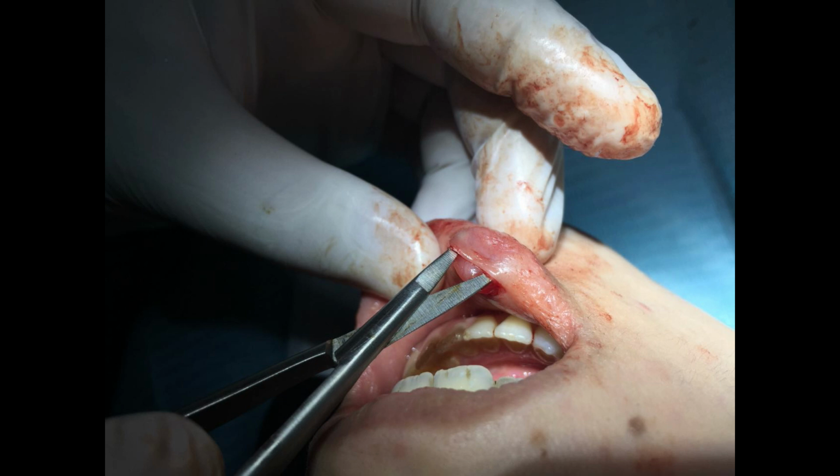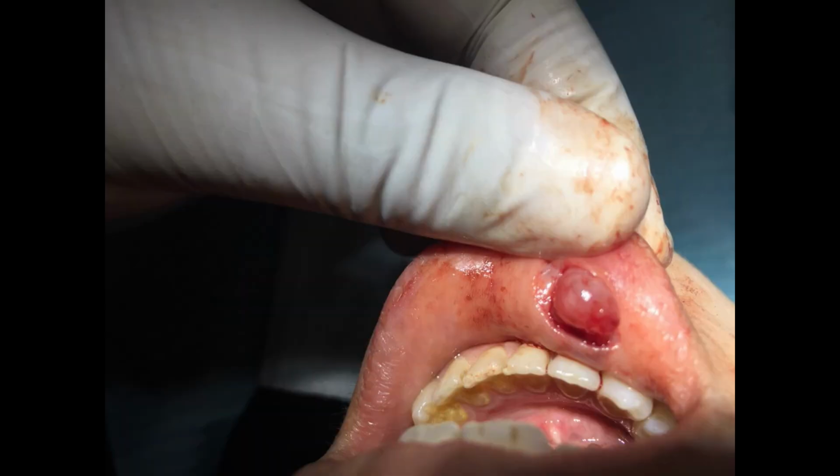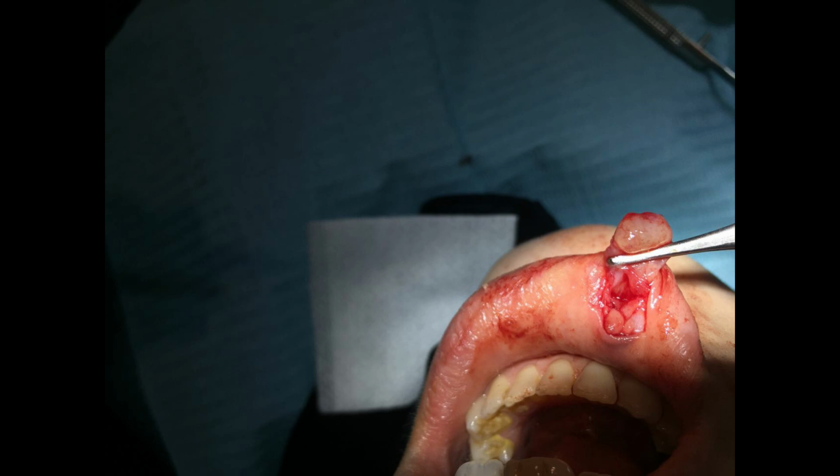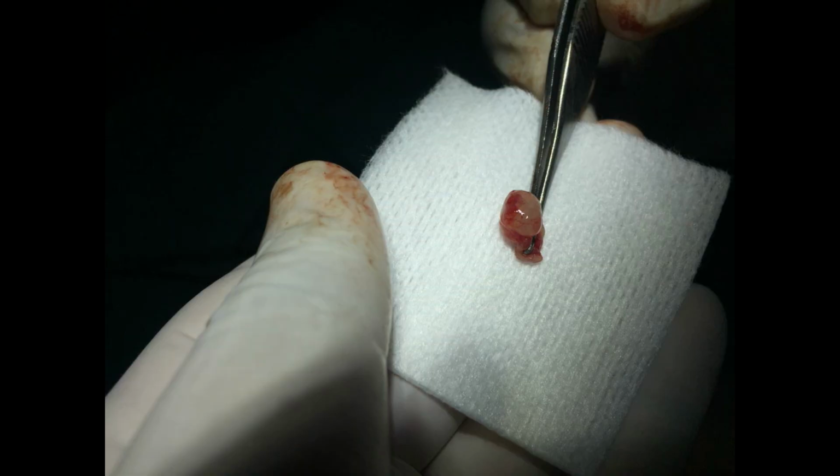We were quite successful in that, and we were able to carefully remove the entire soft tissue from the mucocele attachment, and the mucocele was then extruded with the help of a little digital pressure from the labial aspect, and it just popped up. When it was out, we were able to locate its stalk and its major attachment, and it was secured with the help of tissue forceps, and the whole mucocele along with its content was easily removed and excised.